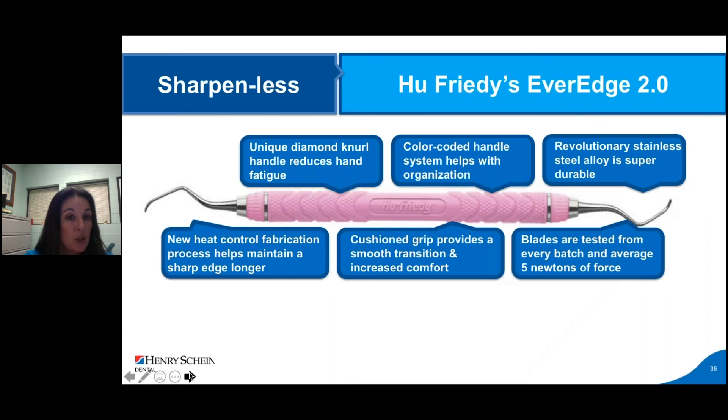The second is the sharpen-less Hu-Friedy EverEdge 2.0. This is a new product and Hu-Friedy is very proud of it. EverEdge 2.0 uses a new optimized heat control process in order to maintain a hard sharp edge. Similar to the original EverEdge technology, the proprietary processing ensures that the superior edge retention and wear characteristics will last the entire life of the instrument. Since it's not a superficial coating, the characteristics can't be sharpened or scraped away. EverEdge 2.0 scalers can be resharpened at any point to extend their life. They are available in both resin and all-metal handles.